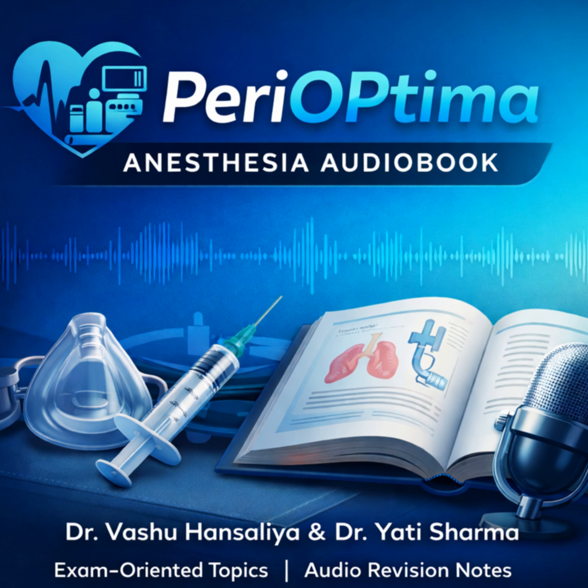Okay, and moving to the high-stakes applications. Difficult airway management. They are critical for two related conditions. First, they're indicated when we anticipate difficult mask ventilation. They secure the airway far better than a face mask. And second, they serve as the crucial rescue device in the unanticipated difficult airway or failed intubation scenario.